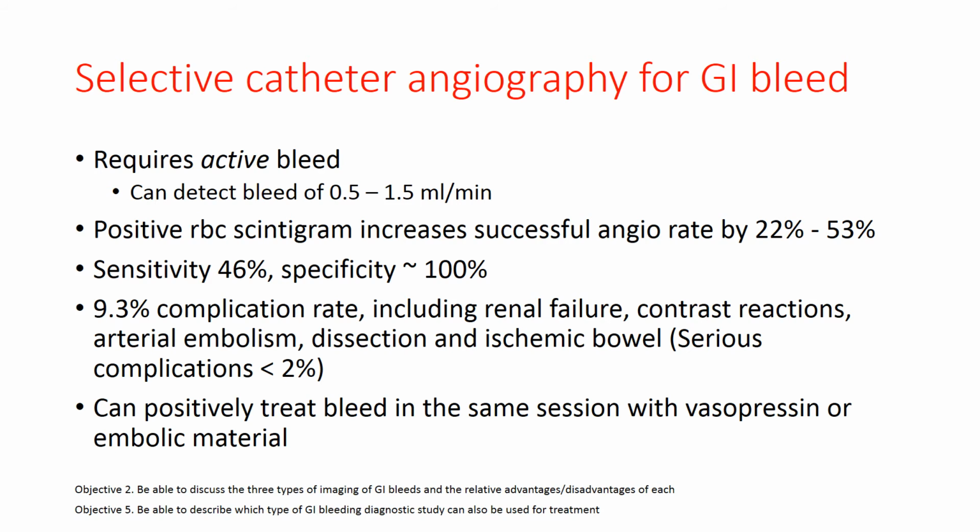We don't want to just do an angiogram of the aorta with all the runoff vessels, or even a superior mesenteric angiogram in which we might get obscuration of the point of bleed. If we see a bleed in the jejunum, we want to select jejunal vessels. If we see a bleed in the ileum, we want to select ileal vessels, and so on.